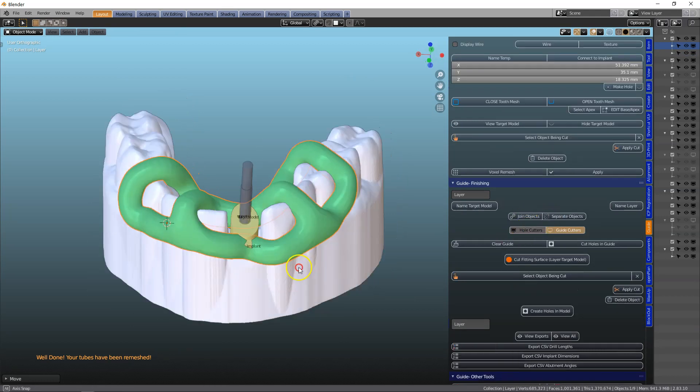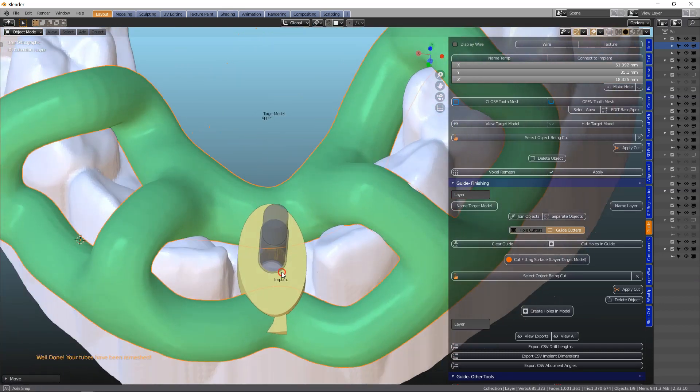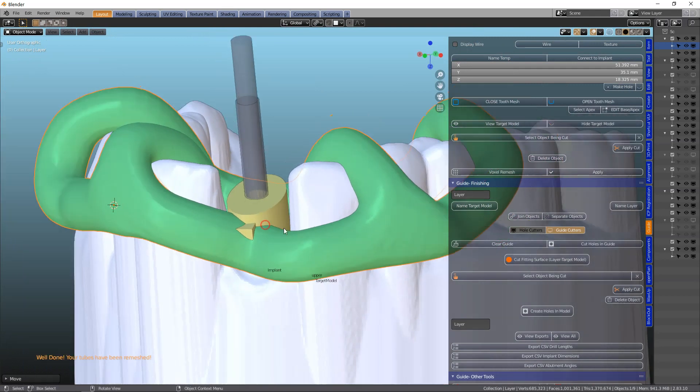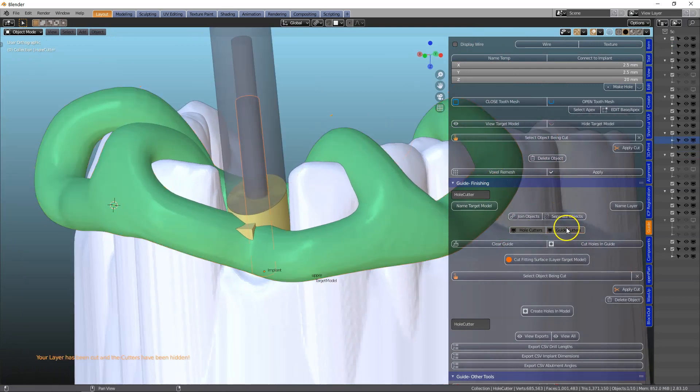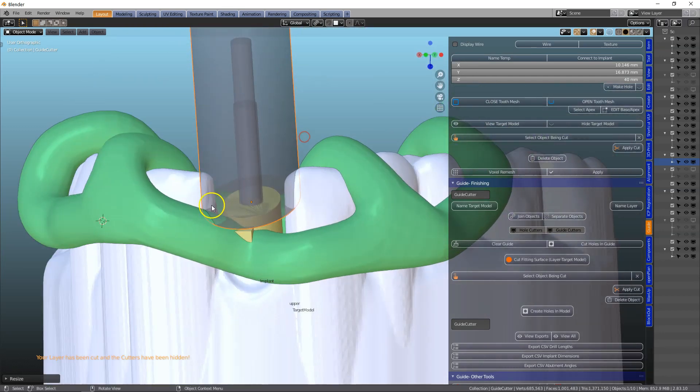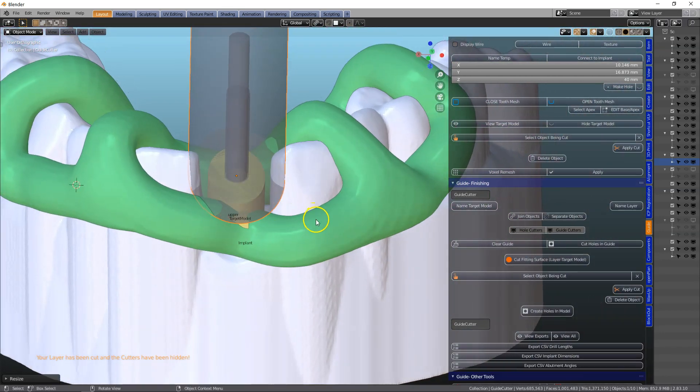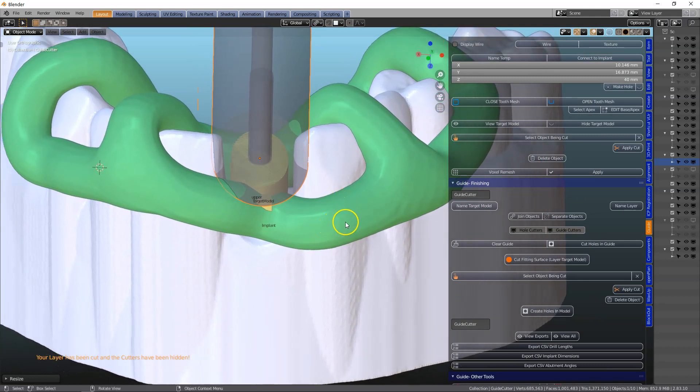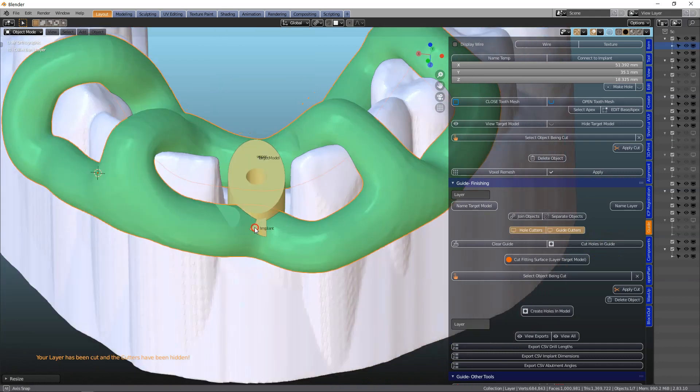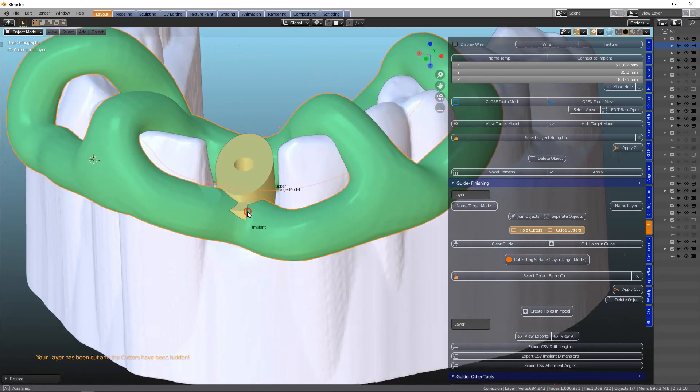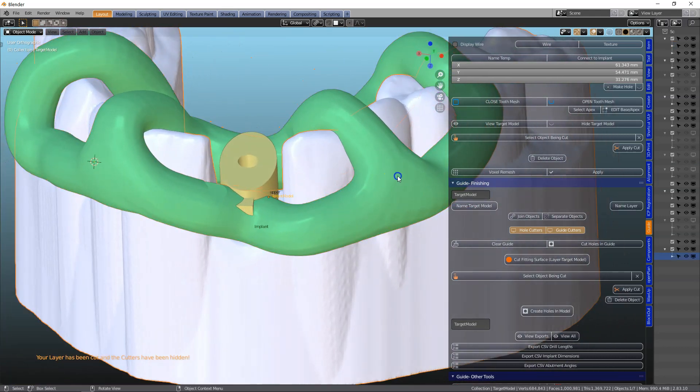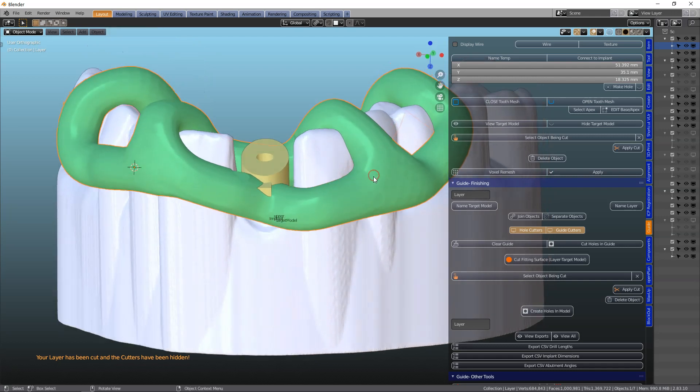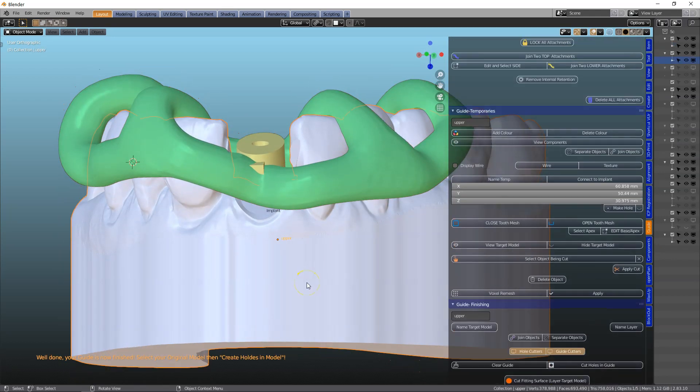We will view our hole cutters. And actually we don't need to do anything there because everything has been cleared. View our guide cutter. We will scale this a little bit like that. Make sure we get rid of all of the intersections. And we will then cut a hole into it. And finally what we're going to do is we're going to make the fitting surface.